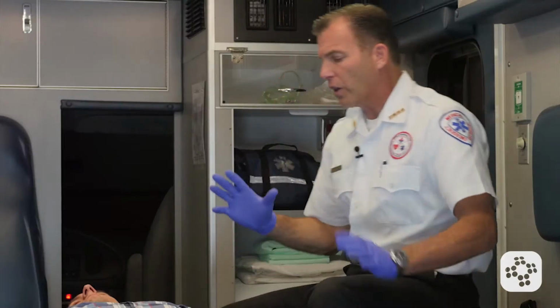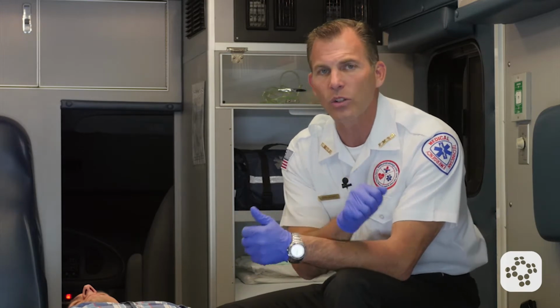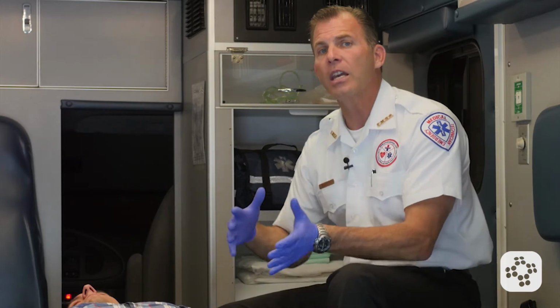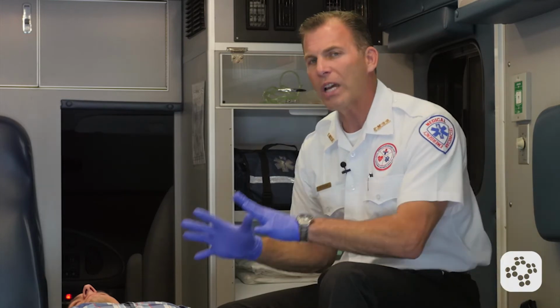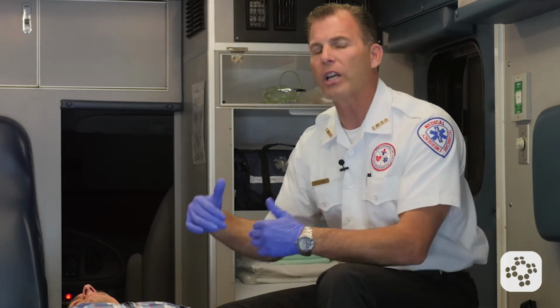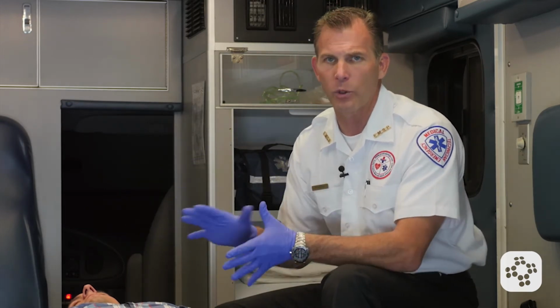Now, there's a couple other things that I want to make note of here as we're talking about defibrillation and the adult patient. We get lots of questions from our students about, well, what if they are a female and they have an underwire bra? Is that going to cause a problem with the AED? The technologies are getting so much better now that we tend not to see those complications as often. But if you believe that it might be in the pathway, disconnect it so that the pathway is clear for the 2 electrodes to defibrillate the heart.